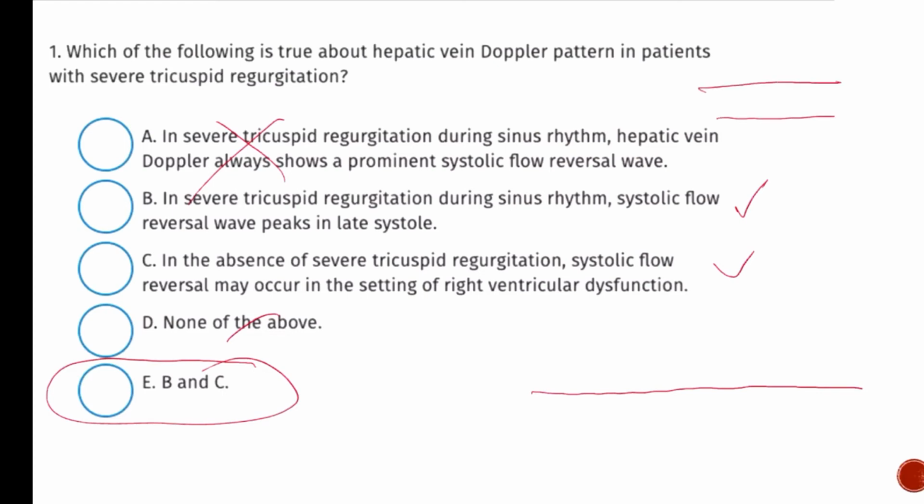So if we look at our IVC, it's going up into our heart, which is here. We have a vein that comes off called our hepatic vein here, all right? Now, why do we measure the Doppler of our hepatic vein versus the Doppler of our IVC? Notice that we never measure IVC Doppler, right? That's a good thought. What angle do we care about for Doppler? We need the velocity to be changing as it's going towards or away from the probe. If the blood flow is going up and down the IVC, there's going to be no change in frequency as the flow goes by because you're measuring this way, okay?